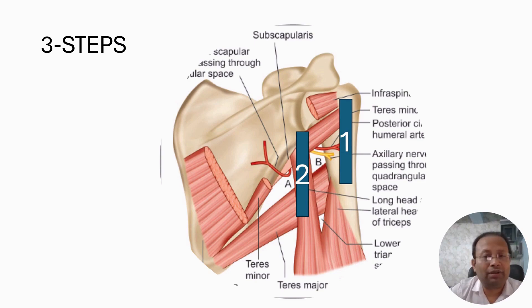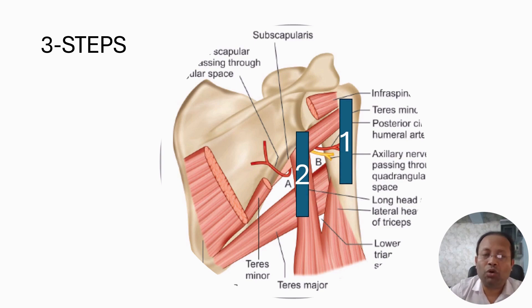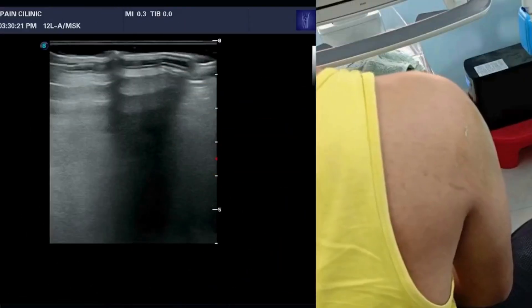Step 3 is just an oblique view from Step 2, where the probe is obliquely directed towards the quadrangular space to locate the neurovascular bundle.